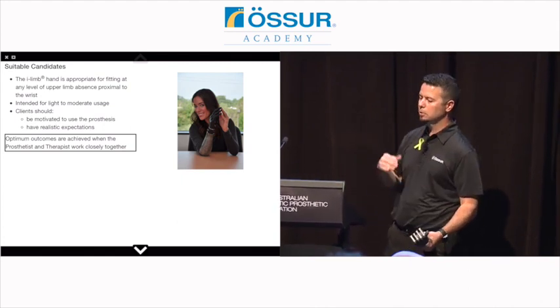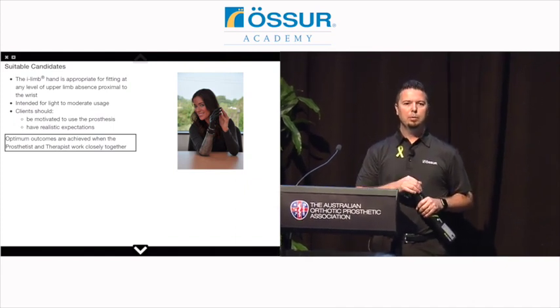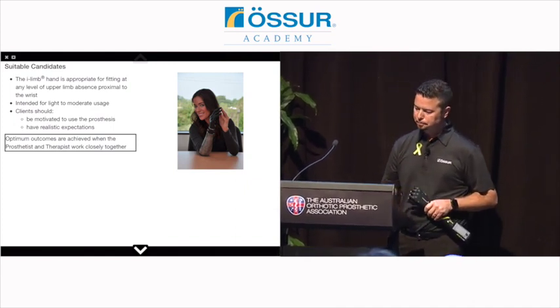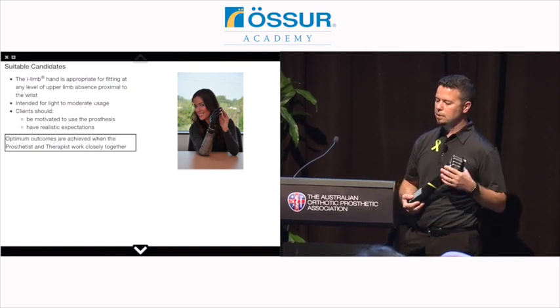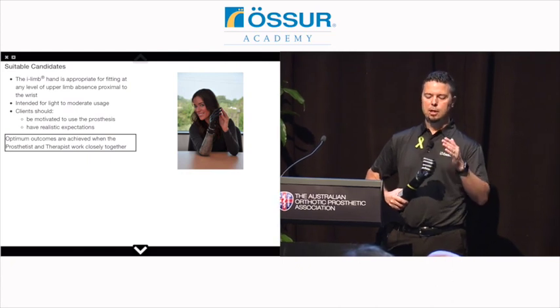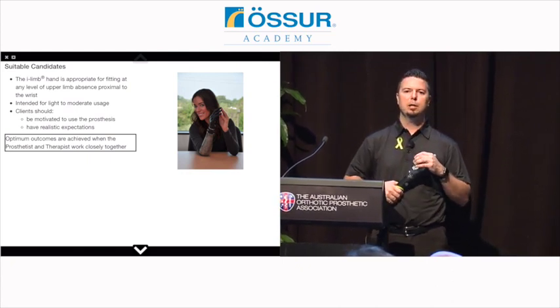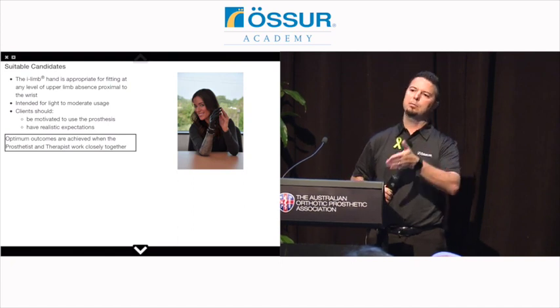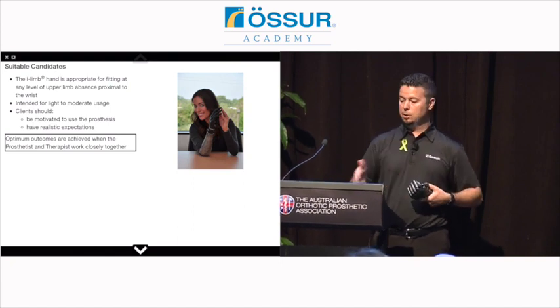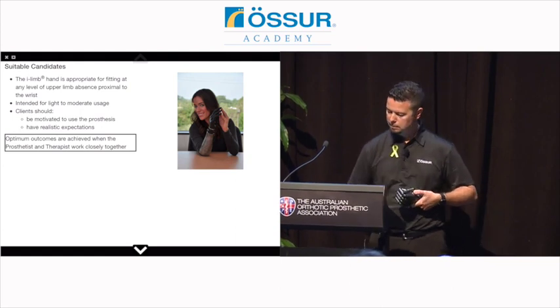Misleading information. So we really want them to have a good understanding of what this hand can do, how it works, and what's realistic. And then we really emphasize using a therapist when working with one of these devices, just because as they become more advanced, to really learn the features and capabilities of the product, you really have somebody that needs to take them through that training staged approach like we're going to talk about. And I'll show you a little bit of that with Nathan as well.